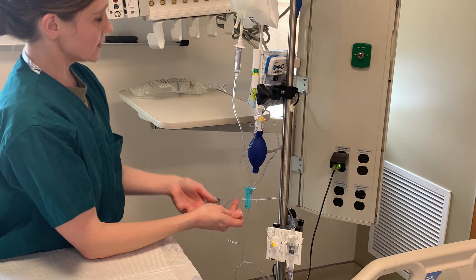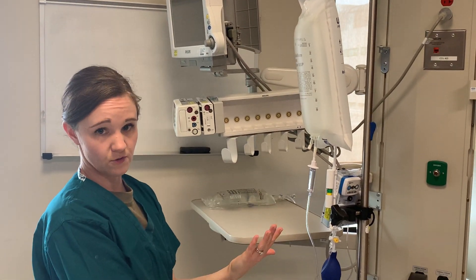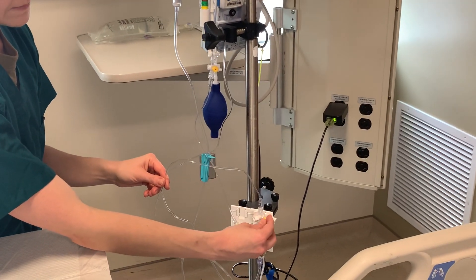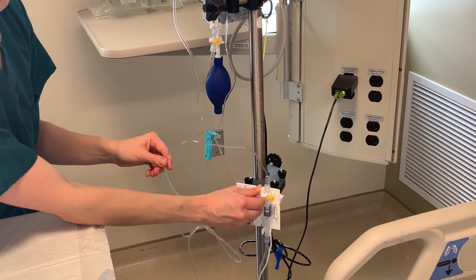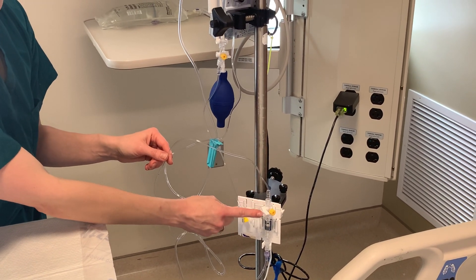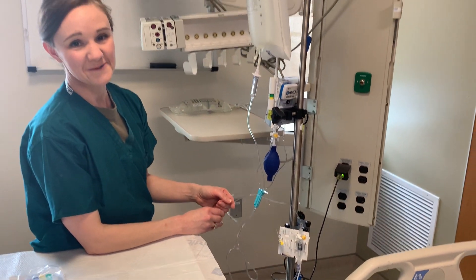After you open this, you will go to your monitor, select zero, and you will see the zero pop up. Once that happens, come back, put the cap back on, and turn the stopcock off to the port — now the transducer is reading the patient's waveform. I hope that helps.